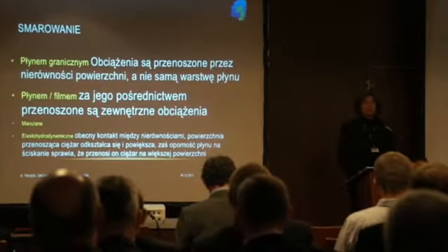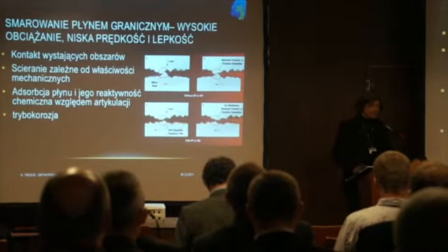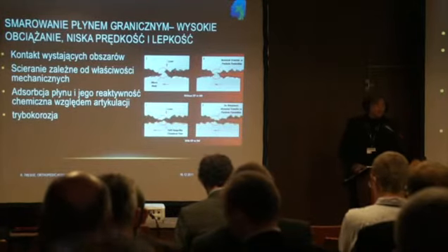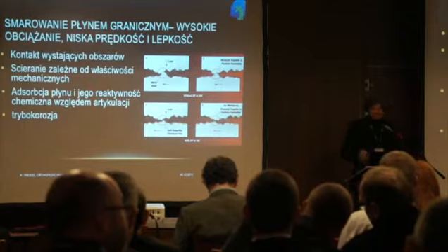The next issue in tribology is lubrication. There are basically two types of lubrication: boundary lubrication and fluid film lubrication. The matter is actually much more complex than that, but nevertheless, we can stick with those two. Boundary lubrication takes place when the lubricant is just adhered to the surfaces. It promotes or eases the gliding. Nevertheless, asperities come into contact and load is carried by the asperities.